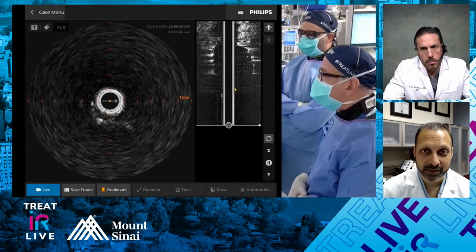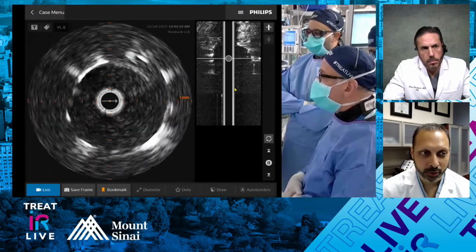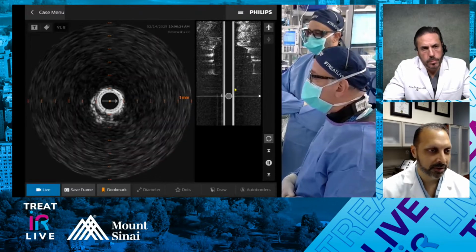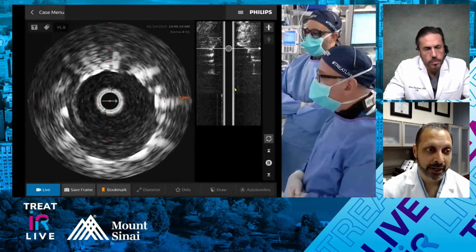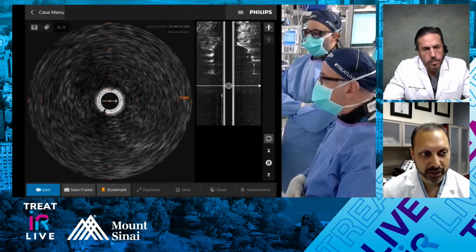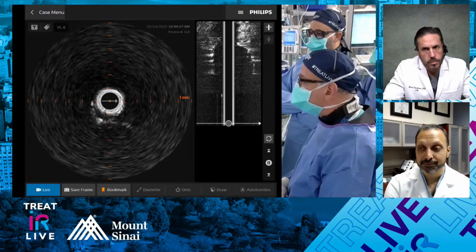I have not typically chased after those that small. Now, there are rare instances where that might be the culprit issue, but I think you had 3 significant stenoses in 4 of the major blood vessels supplying both kidneys. I think you've done a really great job. I'd be surprised if either of those 2 are contributing major factors to this patient's hypertension, and I suspect he's going to do quite well with these 3, and I would let him be.